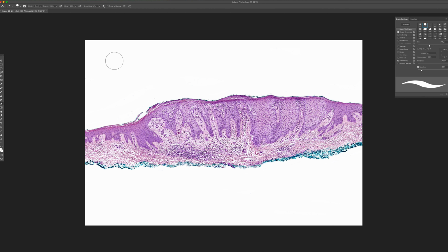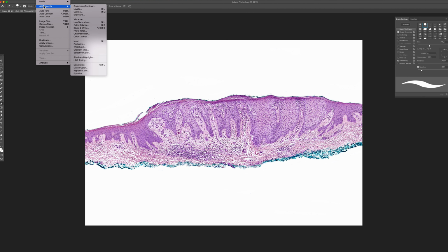So now it's looking good. It's got good contrast. It's sharply focused. It stands out a lot. The only thing I wonder is whether we should mess around with the color a little bit. And there are two ways of doing it. What I'm going to try this time is using hue and saturation.